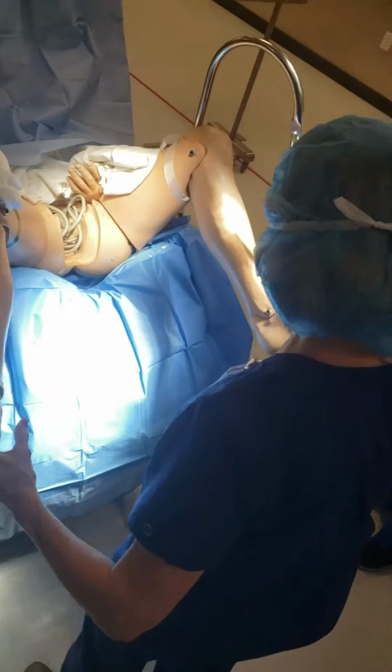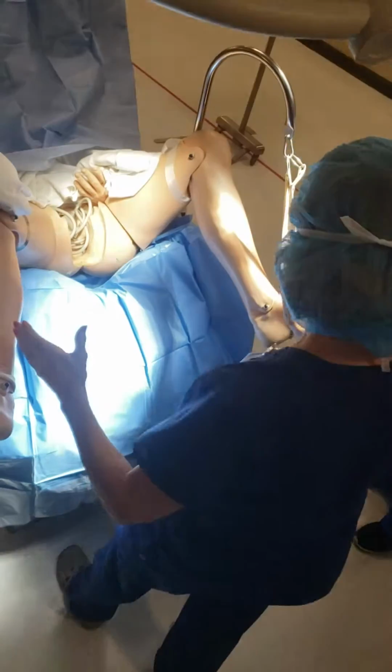Also, when you put a patient up in stirrups, you need 2 people to lift each leg. I'm sorry, 1 person per leg, because the legs cannot go up independently. They go up at the same time, and then they're hooked on.